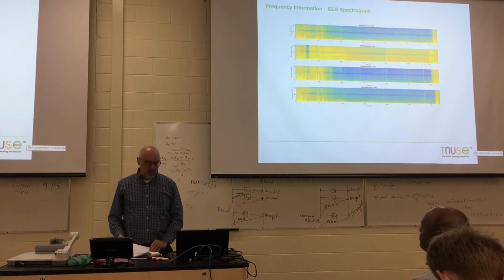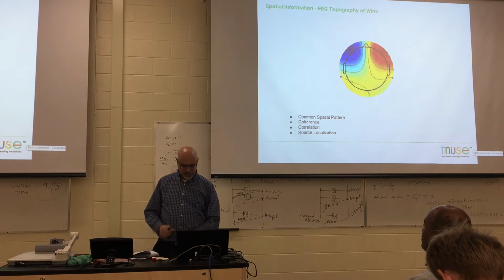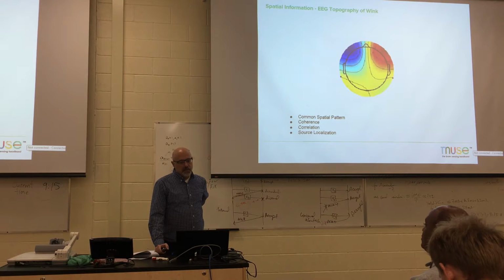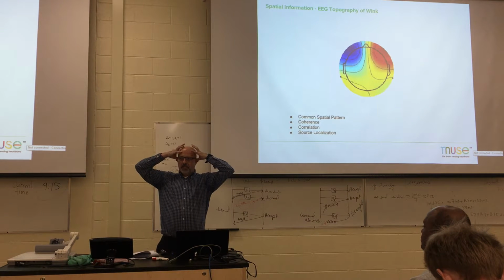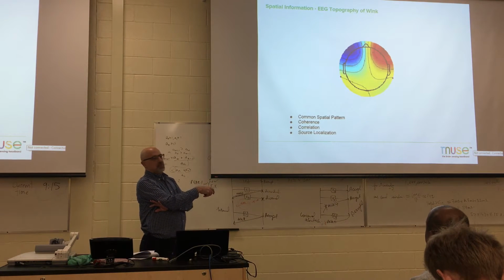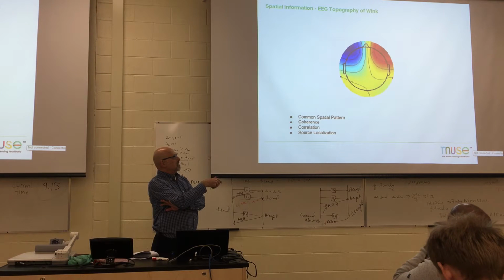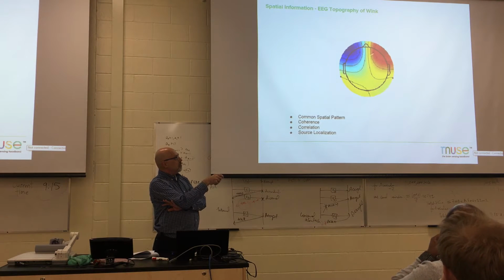So this is a good example of how to just get a picture of what's going on. Another way of getting information: we have 4 electrodes, placed above the ears and on the left and right forehead. And this is a topographical representation of a wink, right? Red is stronger here, and blue is lower voltage. Just using the 4 electrodes of the Muse and plotting the voltages using isolinear lines, you can see there's a lot of voltage coming from the right eye where the wink was.